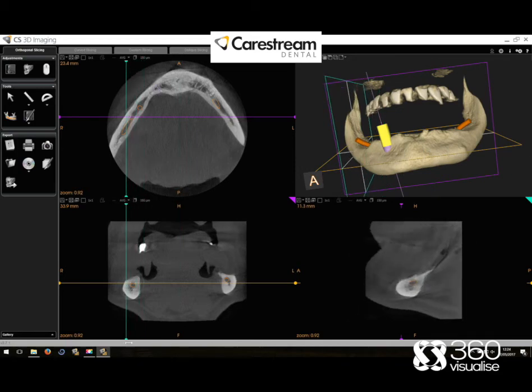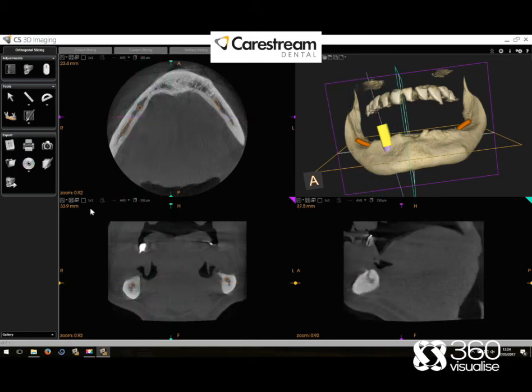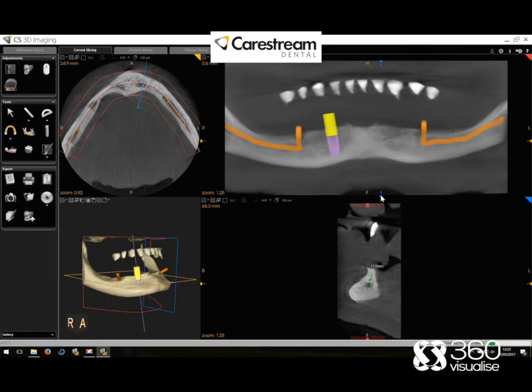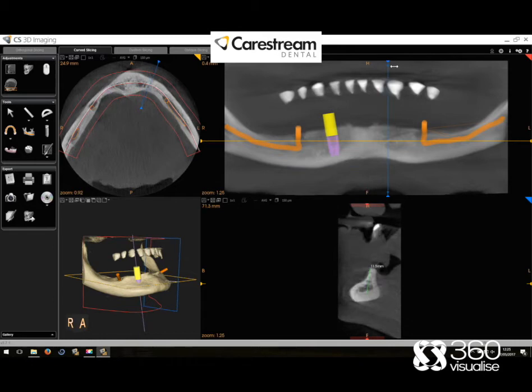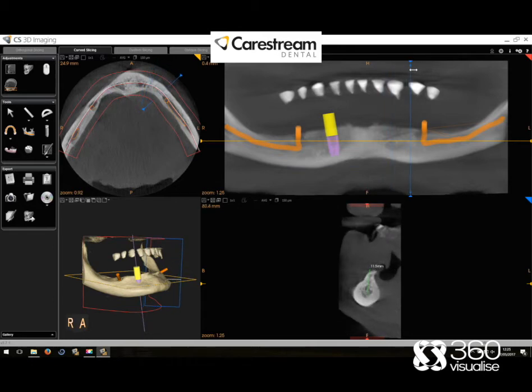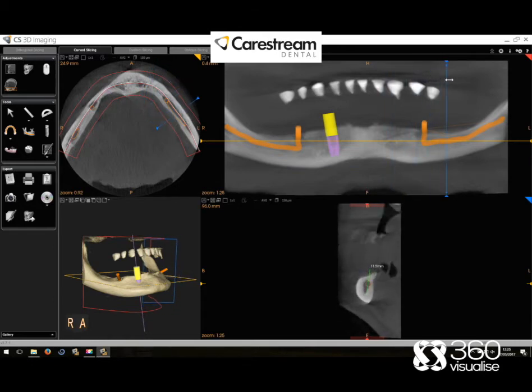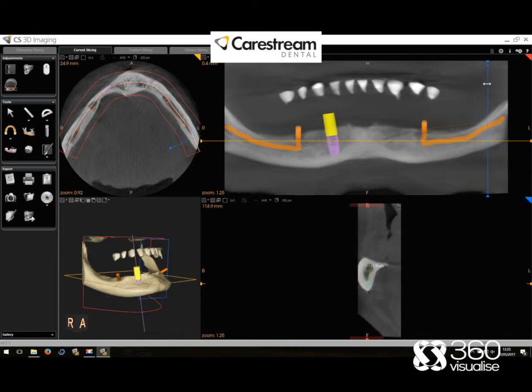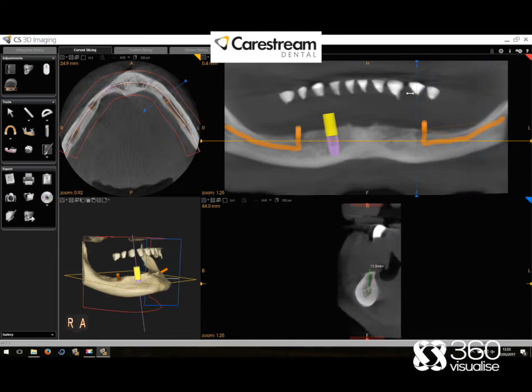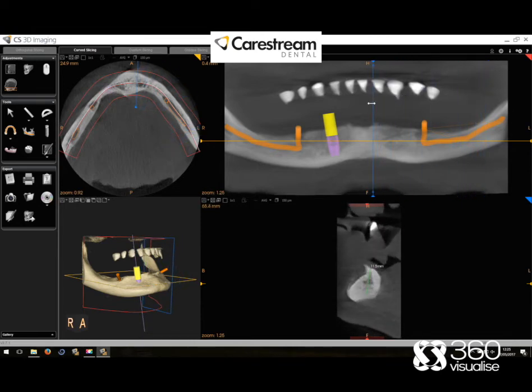For instance here it's really easy to see the ID nerve canal. As you can see now as I'm pulling this blue bar through the OPG view, we can see a nice intersection of the mandible in the bottom right hand corner. This is a nice way to trace a nerve, or if you're looking at a maxilla to check sinus levels. You can take really accurate measurements here from the crest of the bone to the top of the ID nerve.